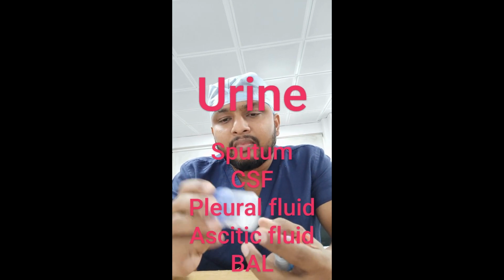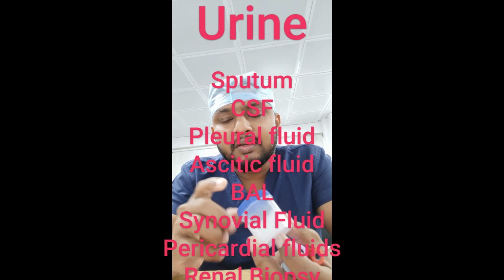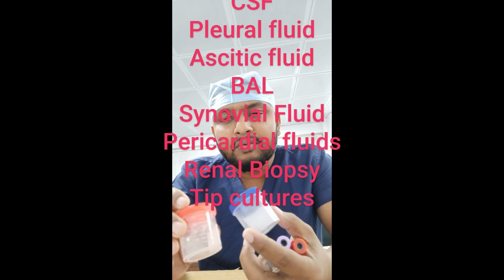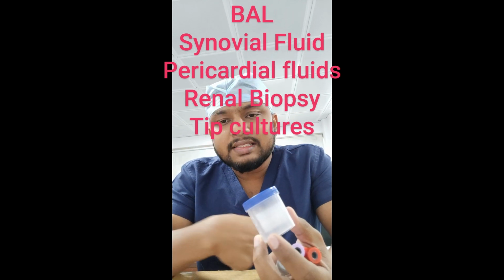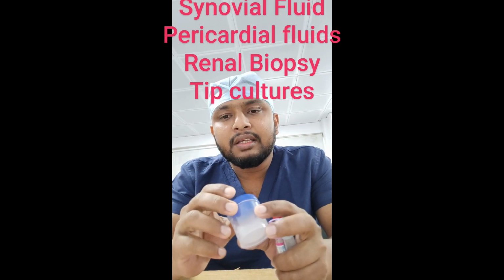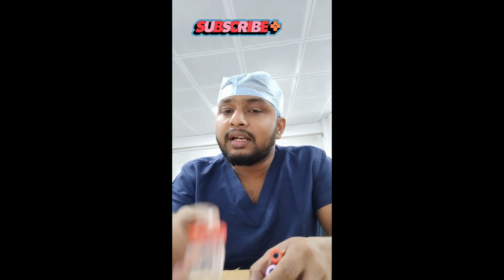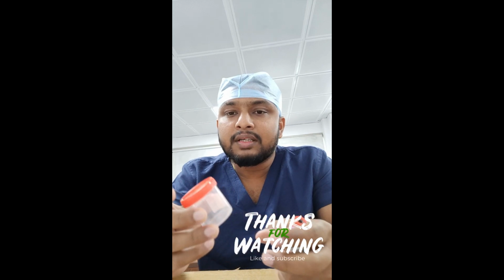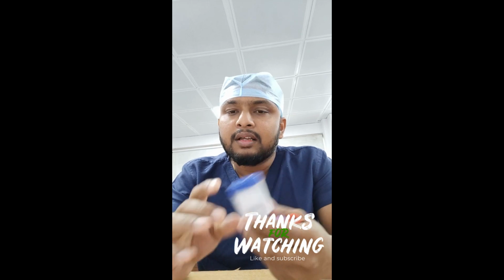Bronchoscopy samples too. You can send body fluids like CSF, cerebrospinal fluid analysis, whether for microbiology, biochemistry, pathology or cytology, in this type of container only. A CSF sample, pleural fluid sample or ascitic tapping sample, whatever it is, you can send in this type of container. You have to label properly on the container which type of sample it is. Or you can send tip cultures also, ET tip cultures, central line tip cultures, whatever culture you want to send, in this type of container.